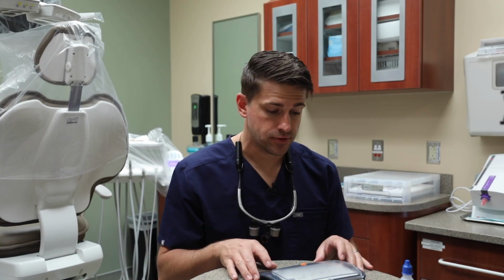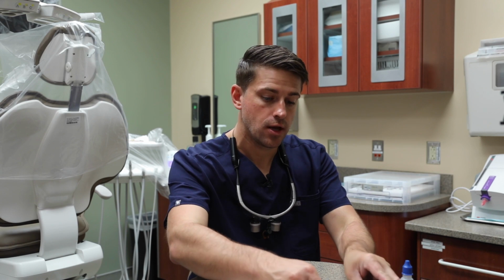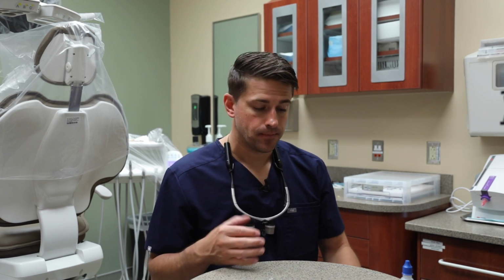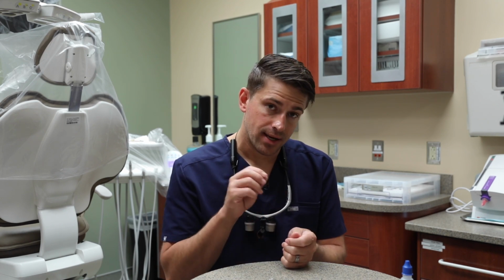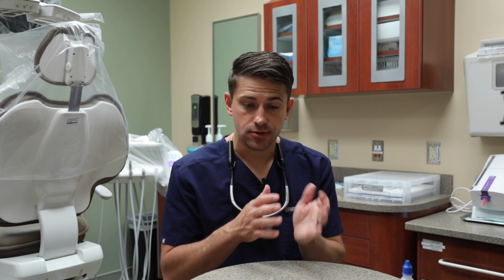All right, so I just pulled the crown out. It's still a little hot, so we're going to have to wait a few seconds on the glazing portion. But there's another thing we need to talk about for this glazing step. Now, when you're applying a separate glaze to a crown after it's already been fired, you will have to refire that. So you need a way to hold the crown, apply the glaze, and not get your fingers all over the crown or even have an obstruction preventing you from getting the glaze onto the crown very easily.